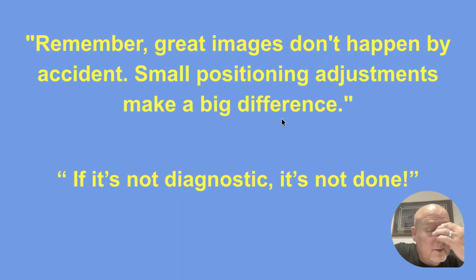Remember, guys, great images don't happen by accident. Small positioning adjustments make a big difference. If it's not diagnostic, it's not done. Work on your rotations with your knees, guys.